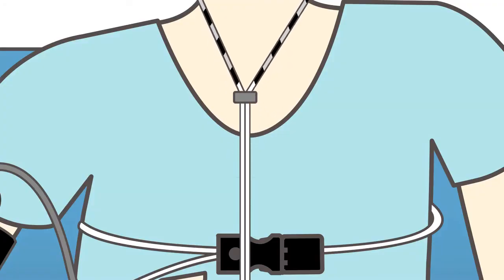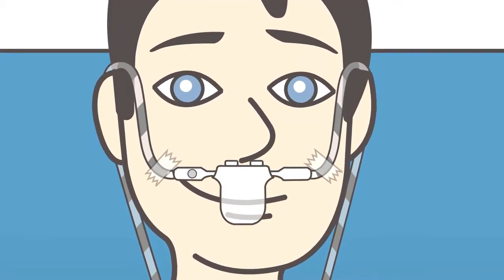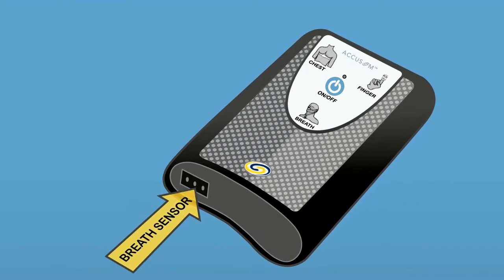You can tighten the slide ring upward and keep the cable in place by using the enclosed medical tape. Plug the breath sensor cable to the bottom of the Accusom.